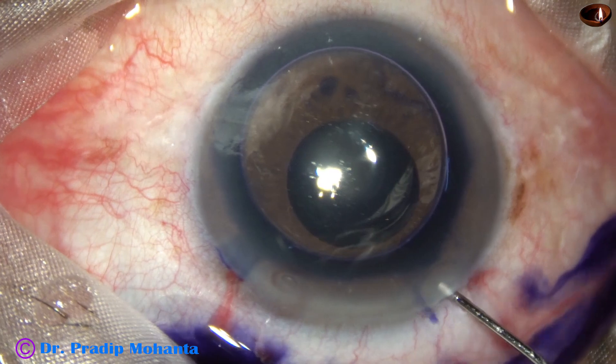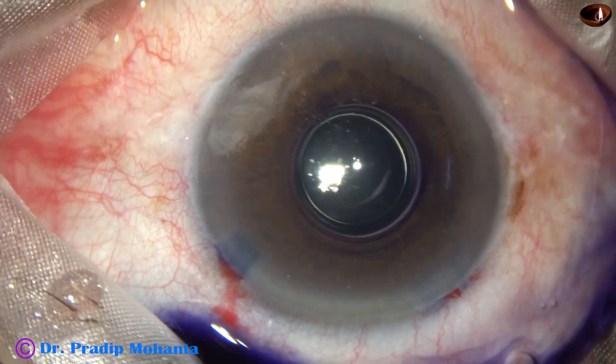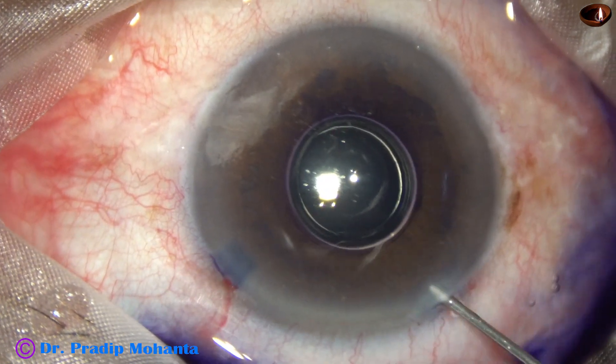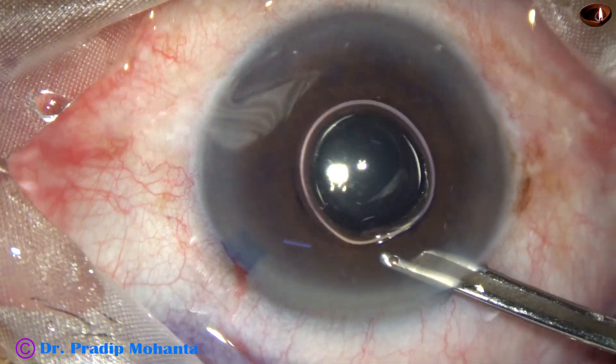The main incision, 2.8 millimeters, has been made mid-limbal. The side port is about 1.6 millimeters and is about 2 and a half to 3 clock hours away from the main incision.